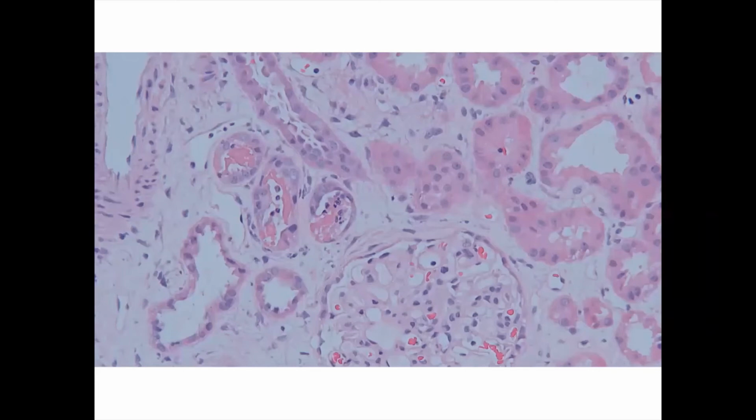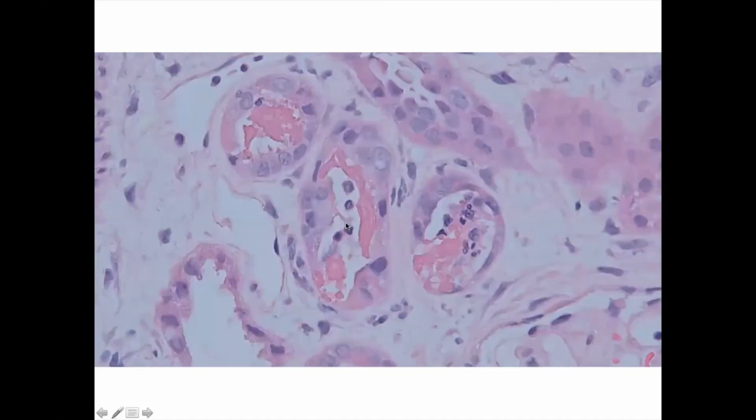So always judge glomeruli على special stains. We have these reddish eosinophilic casts that are يعني causing this erosion في tubular epithelium and acute tubular injury. And yeah, these are reddish casts that are there.